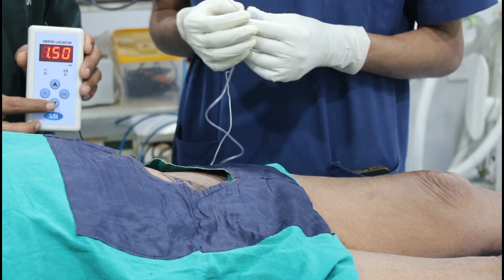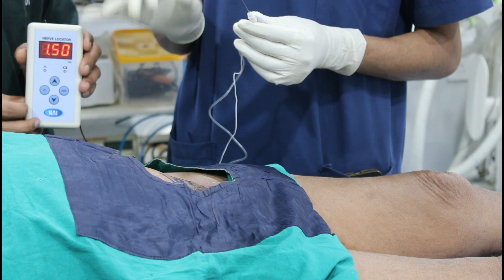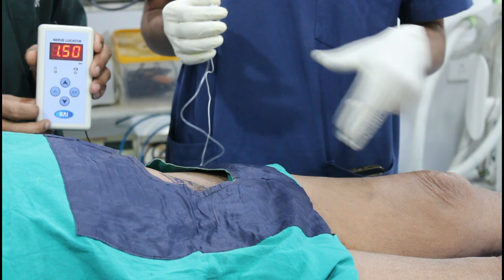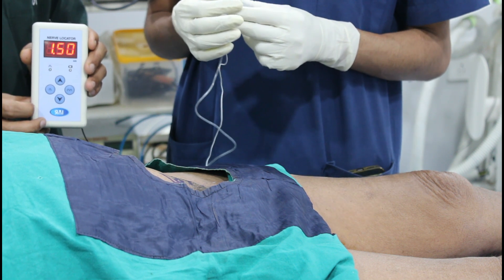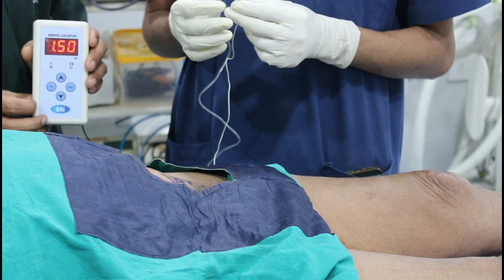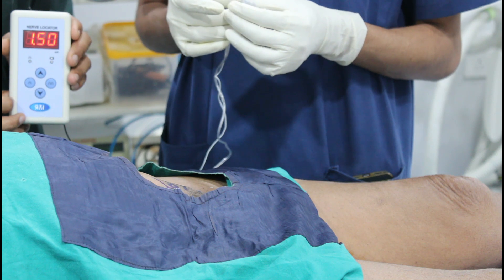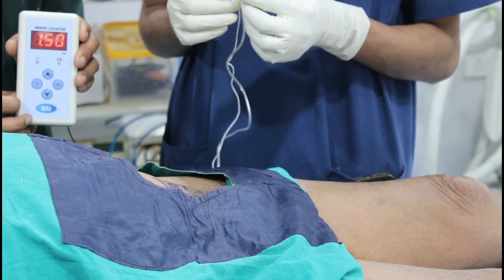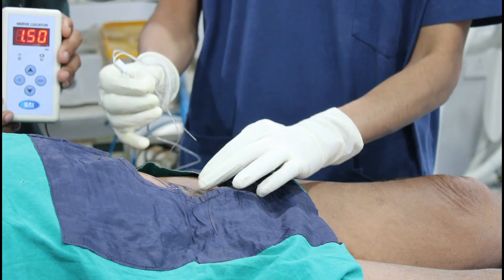Now we will give PNS guided obturator nerve block. Initially we are starting with 1.5mA current and my desired motor response will be the contraction of the adductor compartment muscle at 0.5mA current. So either adductor longus or adductor magnus muscle contraction should be acceptable as an end motor response. For this obturator nerve block, I am using a 10cm insulated Stimuplex needle because this is a slightly larger block.